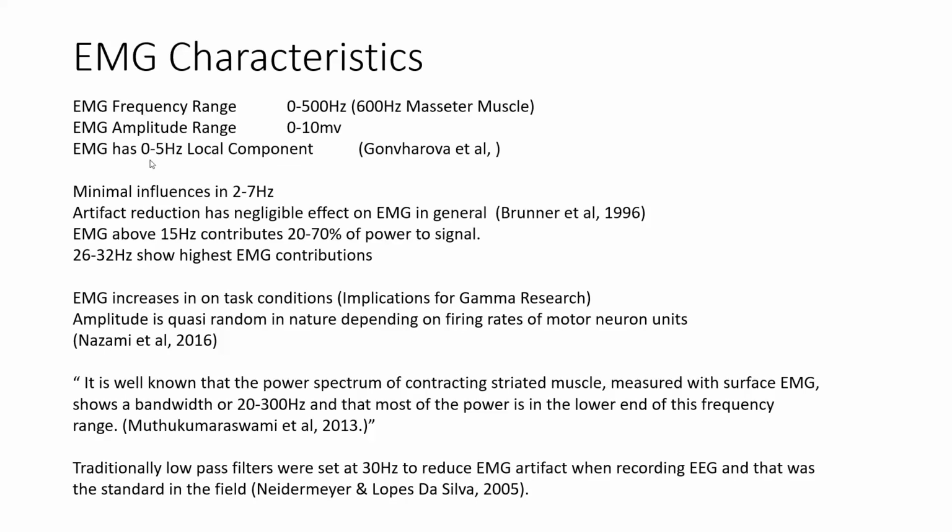EMG does have a 0 to 5 hertz local component. So you may have heard Martin say, well, there is some EMG down in delta. And I'll say, well, no, it's not to speak of. In truth, you're going to have harmonics all the way up and all the way down any scale you measure if you create an event. So from that perspective, it's true. From another perspective, motor neurons start firing in the 0 to 5 hertz range, but it's so minuscule in amplitude that it's negligible, and I'm going to show you that. So it's really something that we don't want to focus on.